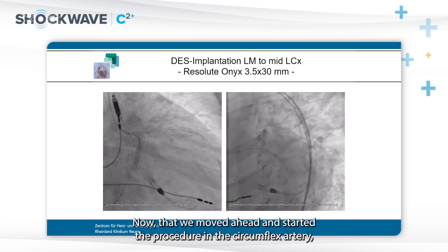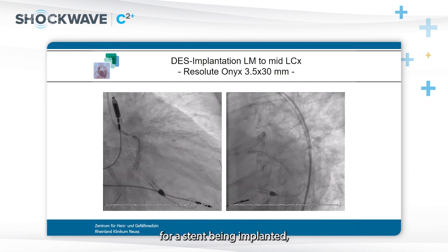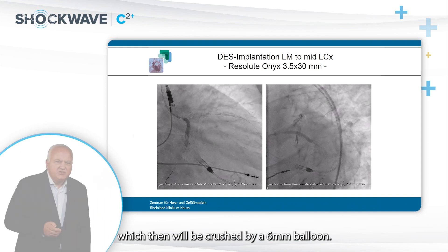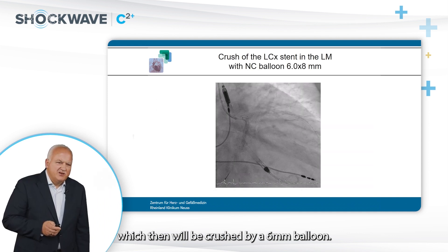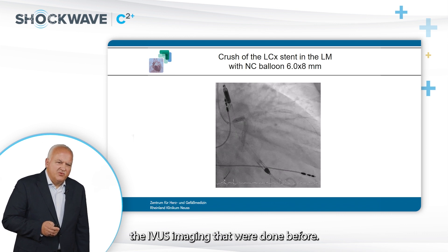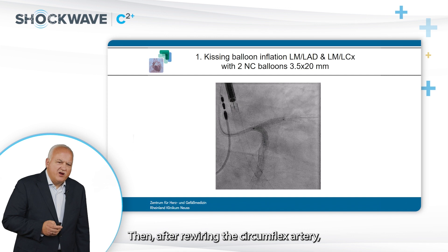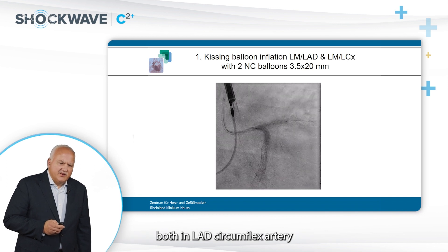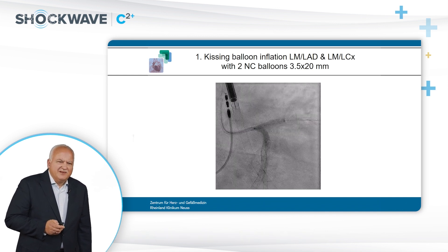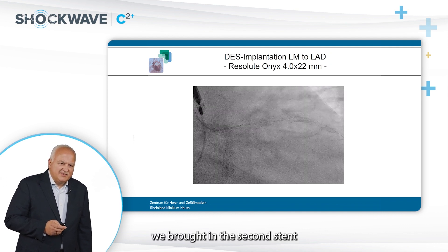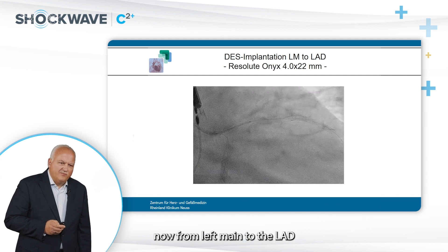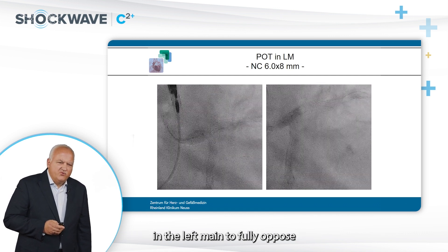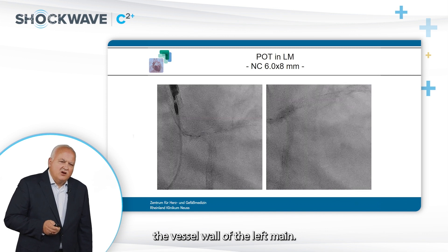We then moved ahead with the procedure in the circumflex artery. The first stent was implanted with a small portion hanging into the left main, which was then crushed by a 6 mm balloon. Dimensions were judged by prior IVUS imaging. After rewiring the circumflex artery, we did the first kissing with two 3.5 mm balloons in both LAD and circumflex artery together in the left main. Then the second stent was brought from the left main to the LAD, followed by a POT procedure in the left main to fully appose the stent struts against the vessel wall.